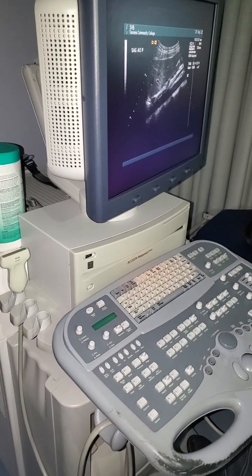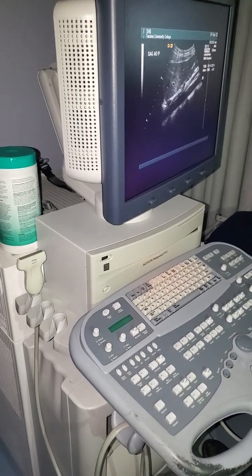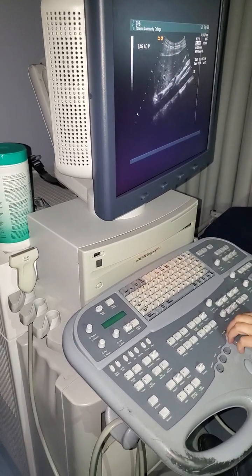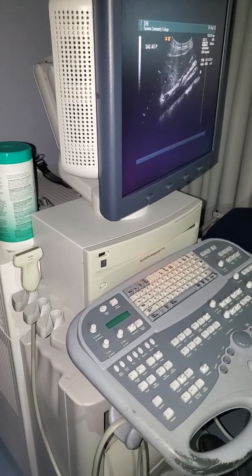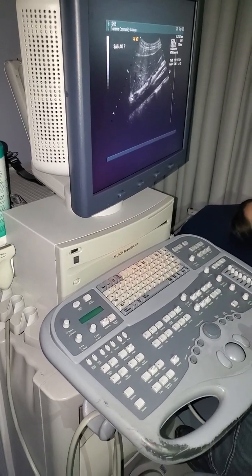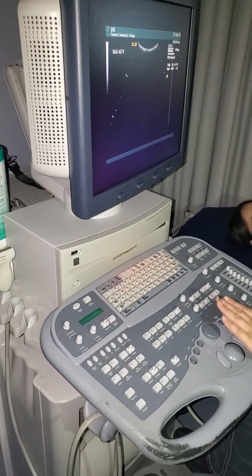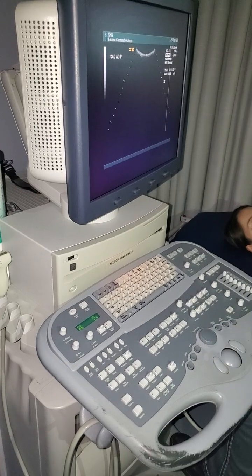And sometimes when you freeze, it's a little bit blurry, or your patient lets their breath out, or you're doing an OB and the baby's like, zzz, and you're like, I need that thing. And so you can actually go back in frames and see what everything's got going. So that's called our cine. And when you guys are doing this, all right, fledgling sonographers, remember that whammy button game where you're like, whammy, no whammies, or whatever. You just have to be gentle, you just have to slightly push it, but you can always cine back, so don't worry, it's not going anywhere.